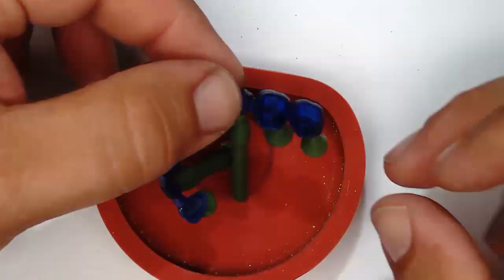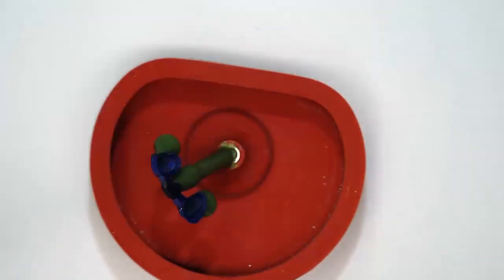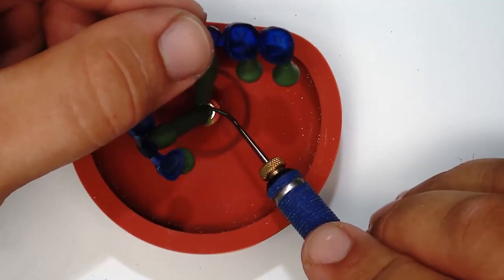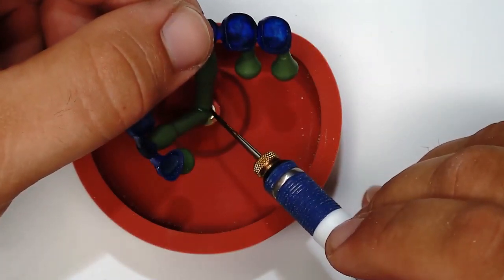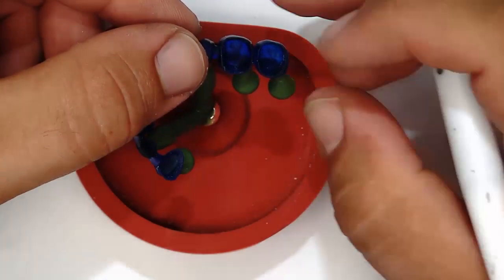The posterior restoration is placed on the muffle former in addition to the already attached anterior restoration. They should be approximately the same height and not in the center of the muffle, but these are things that dental technicians know. What has to be considered during attachment would go too far here.